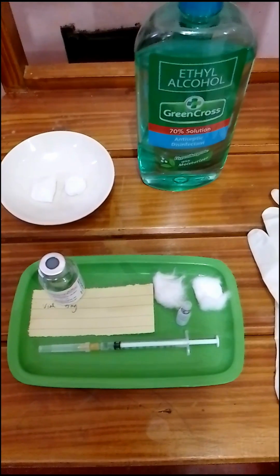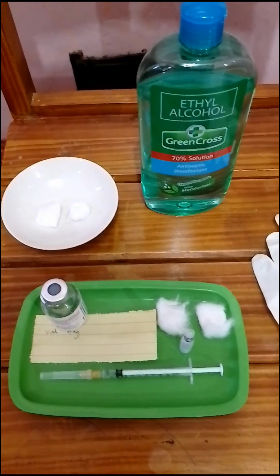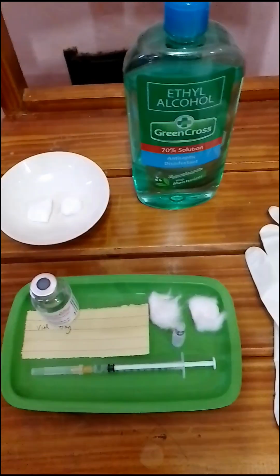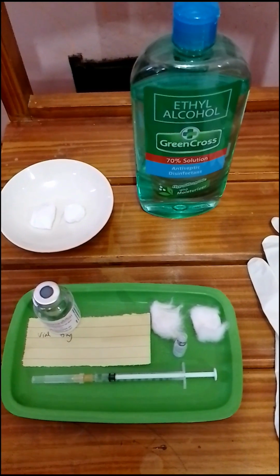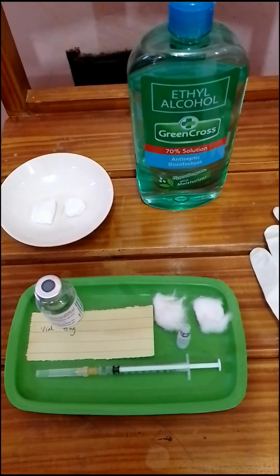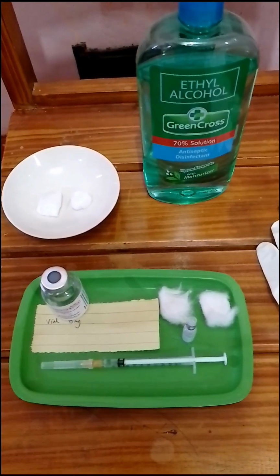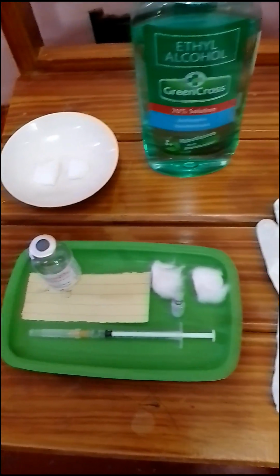Okay. After that, perform hand hygiene. Since I have already performed hand hygiene, now I am going to observe appropriate infection prevention procedures. Arrange the medication card in a hypodermic tray with the corresponding drug. And after that, determine which site will be used and only expose the potential injection site.